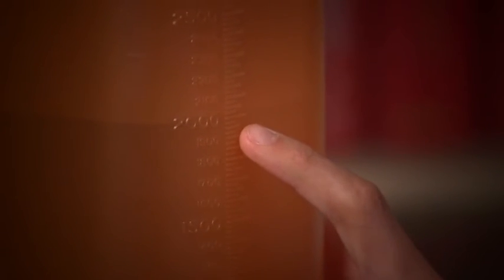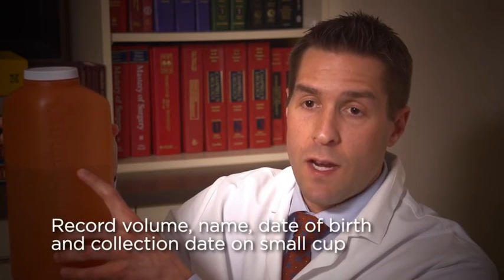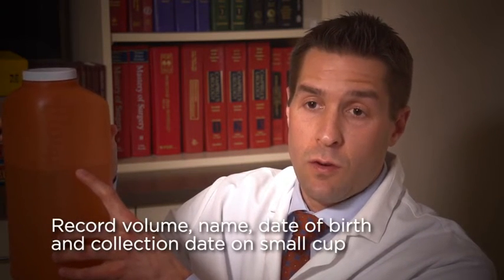It is important that you place the container on a flat surface and measure the lowest point of the fluid level that you see according to the ruler. Take this volume and write it down along with your name, date of birth, and collection date on the small collection cup provided in your kit.